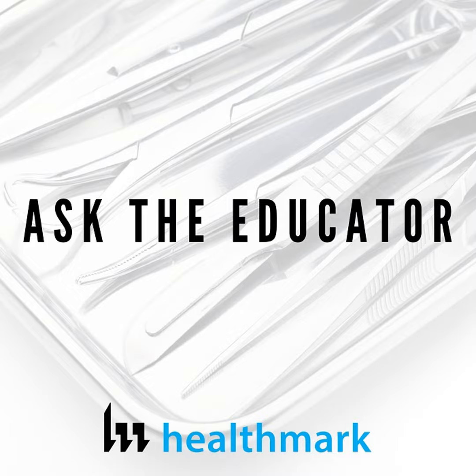It's a little more complicated than, take, for example, transvaginal probes, which all touch mucus-bearing membranes and should all be high-level disinfected. It's very simple to address. Every time before you use it, you high-level disinfect it, so it's straightforward. With surface transducers and percutaneous procedures, it's just more complicated. And that's one thing that's really fascinating about your talk, was you really went into depth about the percutaneous procedures and all the various ways that those can be addressed.